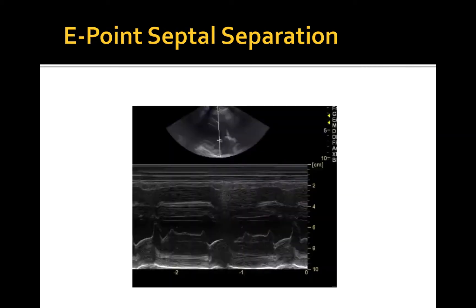This is an example of M-mode obtained by a point-of-care ICU machine to measure EPSS on one of our K9 patients. You can appreciate that the distance between the E-point and septum is minimal and obviously less than 6.5 mm.